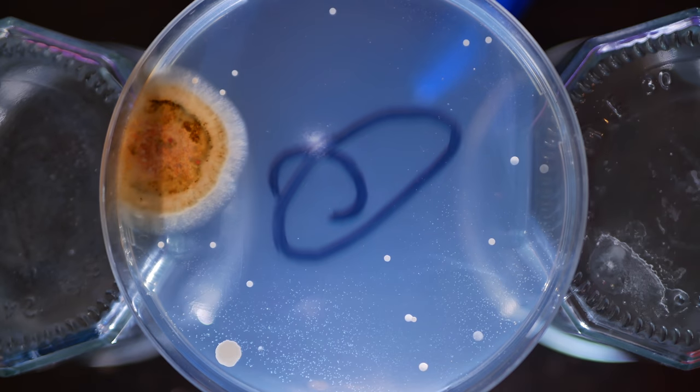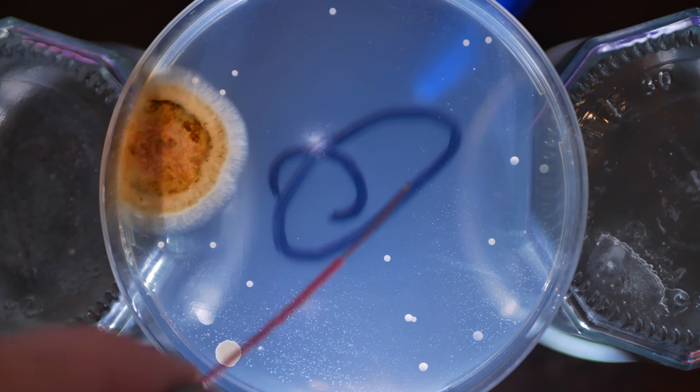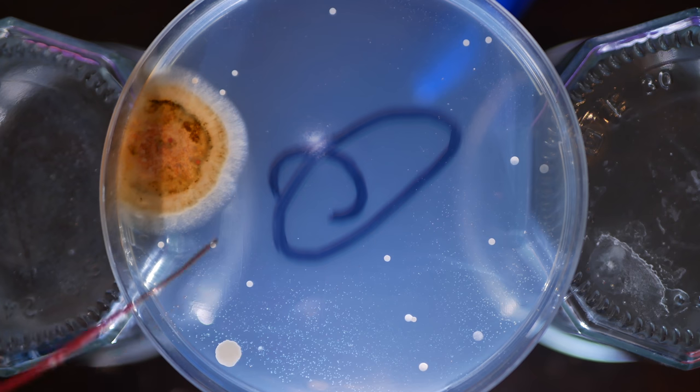And this guy was kind of a bit of a surprise. I don't really know what happened there, but you'll notice the same treatment area has virtually no growth inside of it, while outside there is growth present. So small sample size, yes, but the results are pretty indicative. Cold plasma's able to sterilize a surface without burning it.